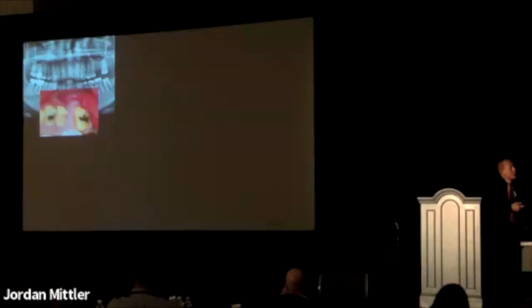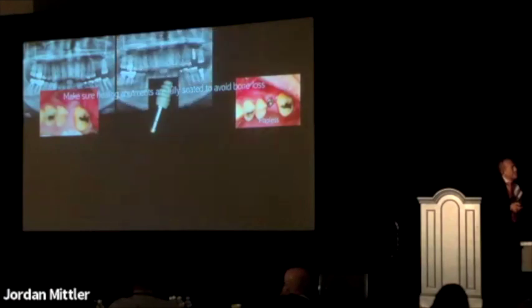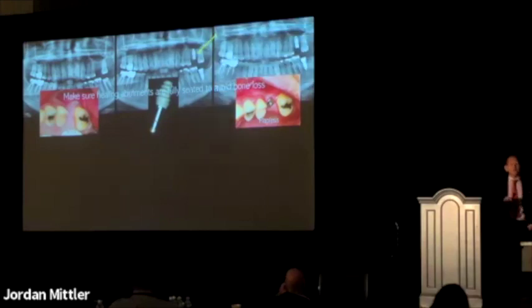Now, I like to place my implants flapless. Probably 80 to 90% of the implants I place, I make a little nick in the gum, I push the gum out of the way, and I insert the implant through. And like some of the other speakers, I never punch the tissue. But the one problem with doing that is sometimes I don't see when I put on the healing abutment. So I always recommend that after you do, take an x-ray to make sure that your abutment is fully seated, because just because you think it is and it isn't, you will have bone loss. So when I see a slight opening, I tighten it down.